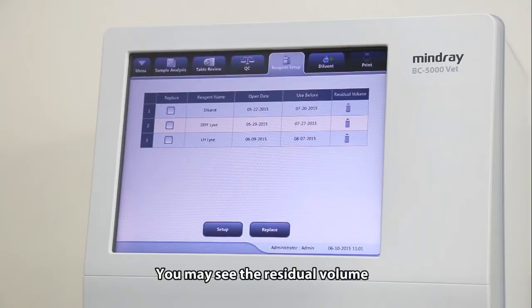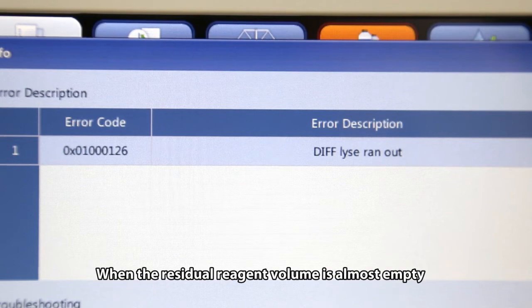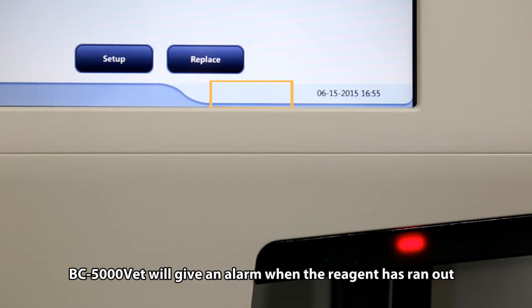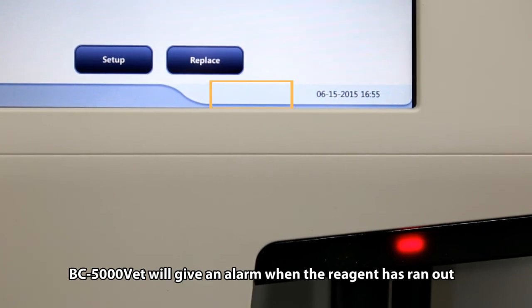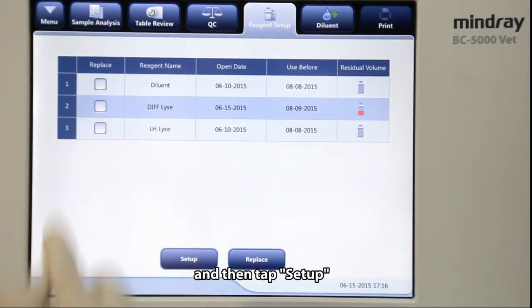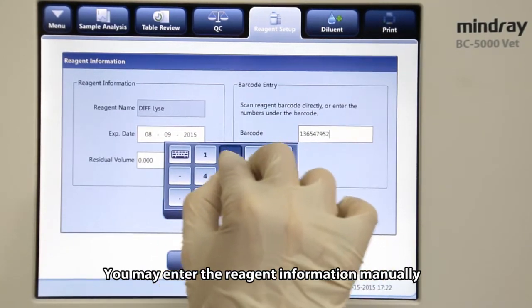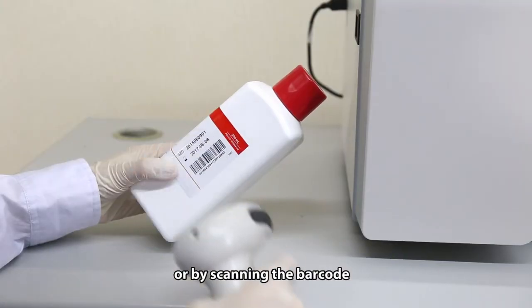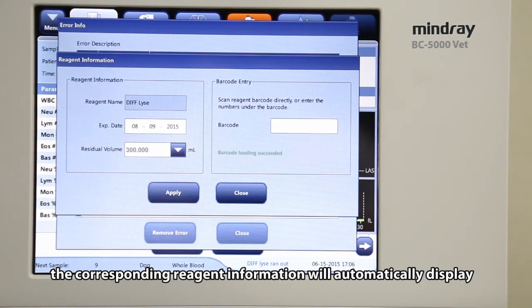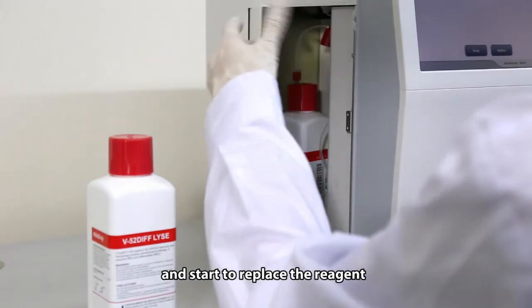You may see the residual volume of reagents on the software screen. When the residual reagent volume is almost empty, it will be highlighted in red. BC 5000 VET will give an alarm when the reagent has run out. Tap the reagent you want to replace and then tap Setup. You may enter the reagent information manually or by scanning the barcode. If the barcode is valid, the corresponding reagent information will automatically display. Tap Apply to save the expiration date and start to replace the reagent.